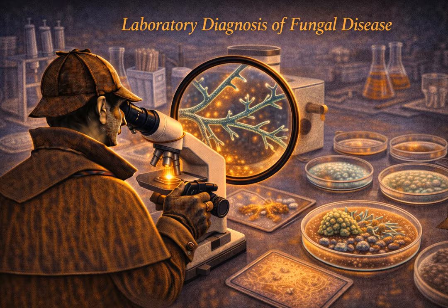So the main advantage here is the speed of screening the slide. Massive advantage. With a standard KOH prep, you have to scan the slide very slowly, usually on high power, looking for faint ghost-like lines. With Calcofluor, you can scan the slide at low power very quickly. If there is a fungus anywhere on that slide, it will scream at you from the dark background. It's the difference between searching for a flashlight in a dark room versus searching for a clear glass straw in a swimming pool. Okay, so KOH clears the junk, Calcofluor makes it glow.